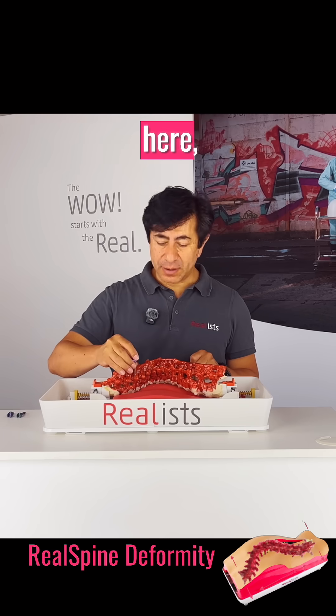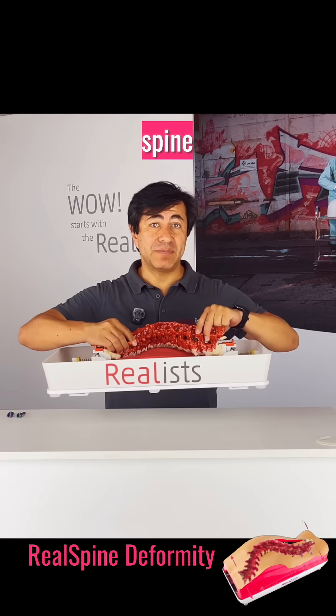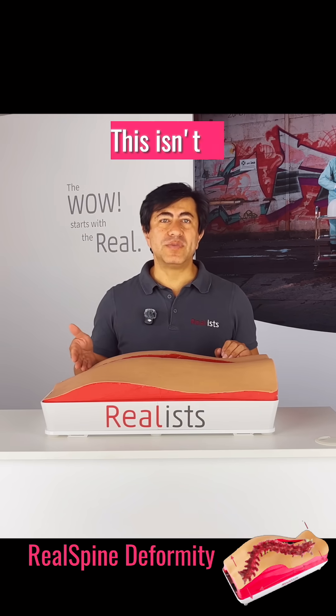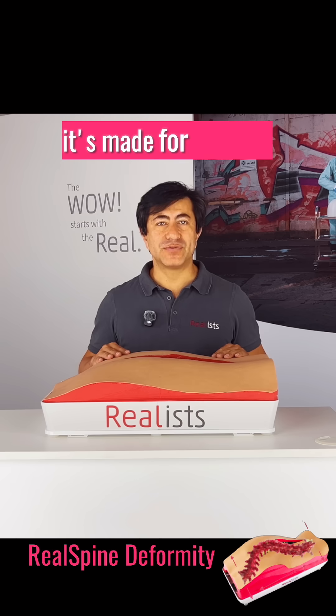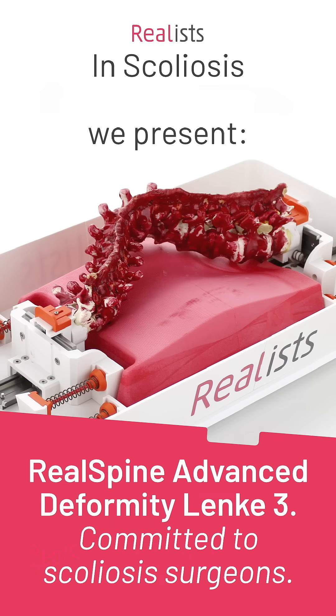When you place a screw here, it holds. It's so real that you could lift the entire spine by the instrumentation — that changes the training experience. This isn't a simulator for showing, it's made for training, and when surgeons try it, they really feel the difference.